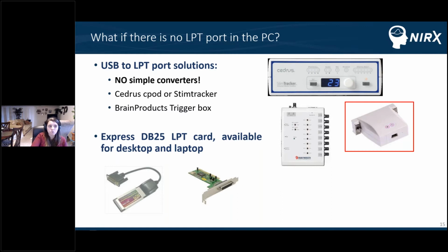Another option is to use an Express DB25 LPT card that is available for desktops and laptops. So you can actually insert the port into the motherboard of some computers, not all. This is something you're going to want to confer with your IT department on.